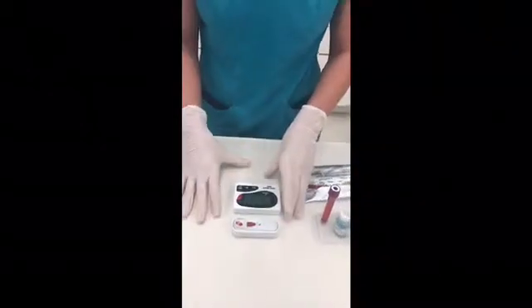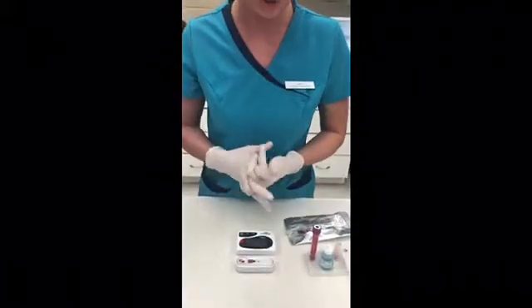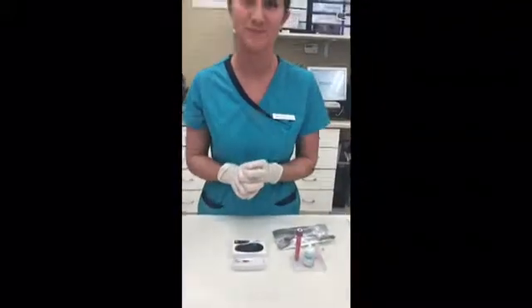And I do want to mention that this test, the conjugate and the sample, was warmed up for 30 minutes prior to this test, which is according to the manufacturer's instructions.